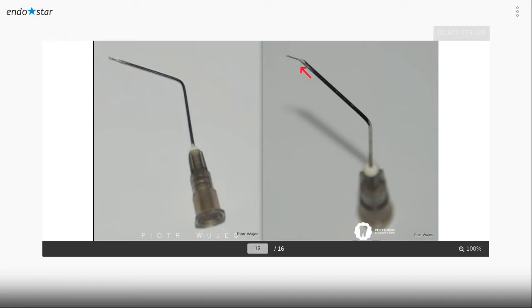Why phosphoric cement with a rapid setting time? Because it's cheap, and it also has, as the manufacturer says, a rapid setting time, but sometimes we need to wait 2 or 3 minutes for the material to fully set. And the third reason why I'm using phosphoric cement is that sometimes we remove just the needle, and the phosphoric cement stays connected to the broken instrument inside the canal lumen.